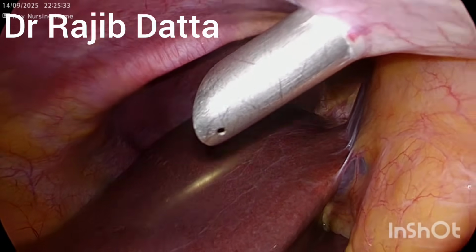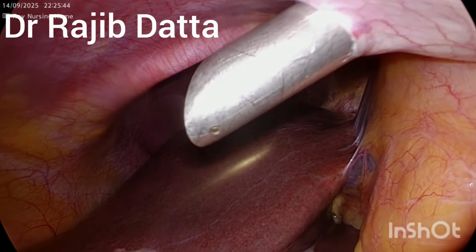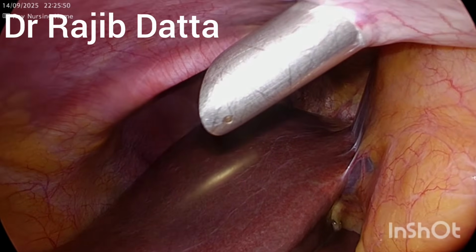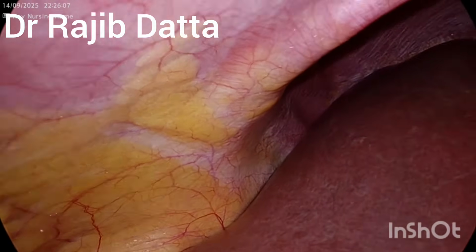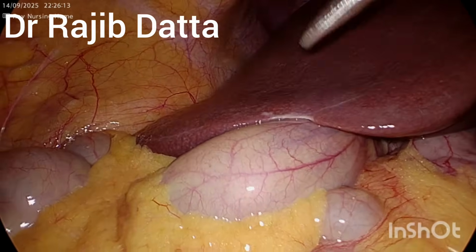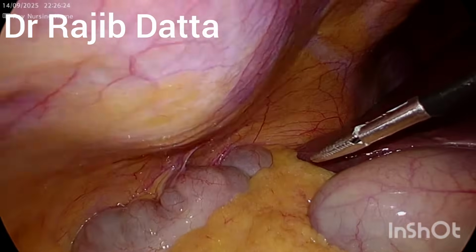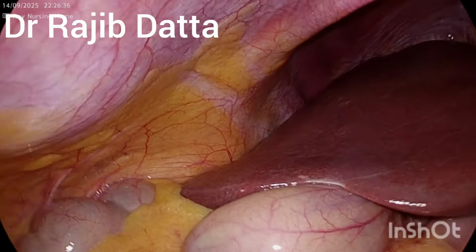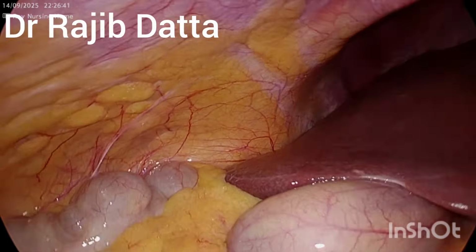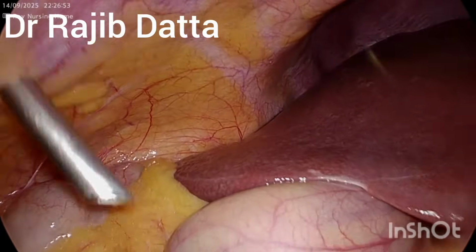And now we are going to introduce the 5 mm mid-clavicular port. The operation here is done under general anesthesia because of her uncontrolled BP. Though the sugar is now controlled under medication, the pressure still remains not properly controllable. So the 5 mm mid-clavicular port has been introduced.